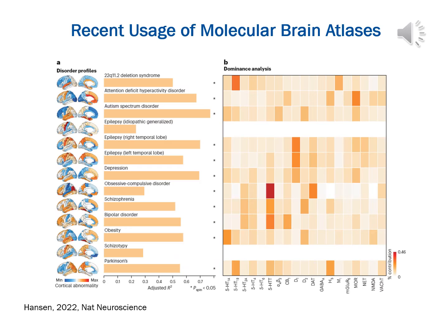Brain atlases are becoming increasingly useful as reference tools for new studies and for comparing healthy brain function or disease states. A very good example of the usefulness of brain atlases was recently provided by Hansen et al. 2022, where atlases of multiple molecular targets were used to investigate the association with brain function and disease. As we have collected multiple SV2A PET scans as part of ongoing studies at NRU, we decided to leverage this data and create a new high-resolution atlas of SV2A density in the human brain.